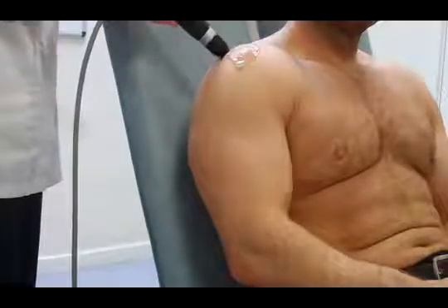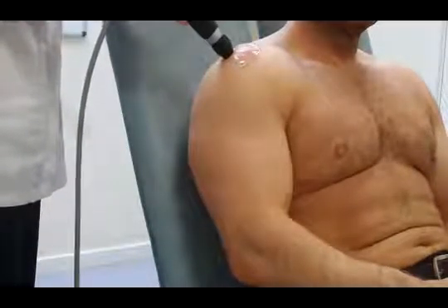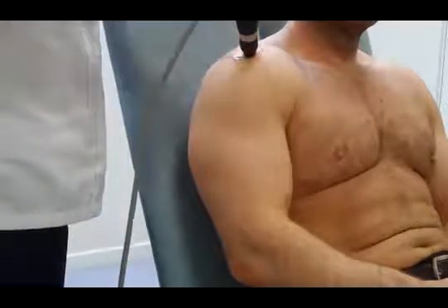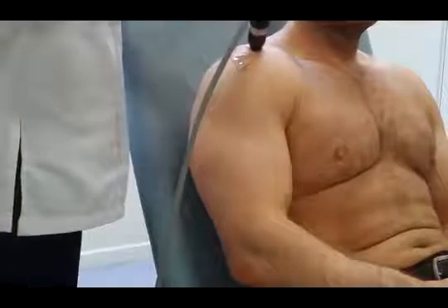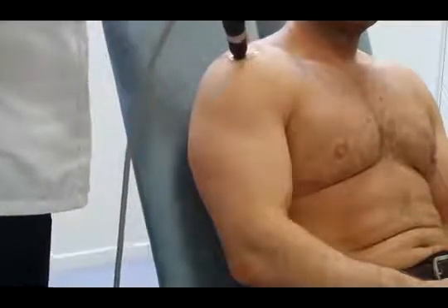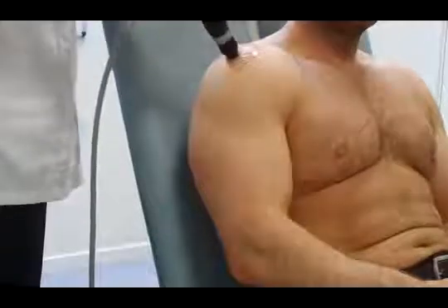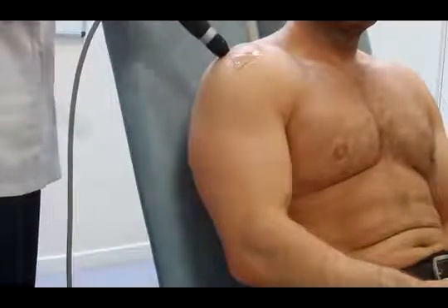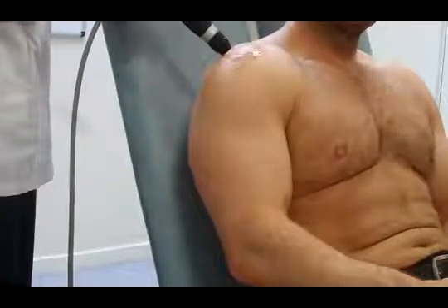Working from one side of the shoulder to the other side of the shoulder. There may be painful areas that you might want to concentrate on. In this case there's a painful area at the back and a focal area, a painful area at the front. Some people would call those trigger point areas. They're probably just the most tender part of the supraspinatus tendon in the condition as it is at the moment.